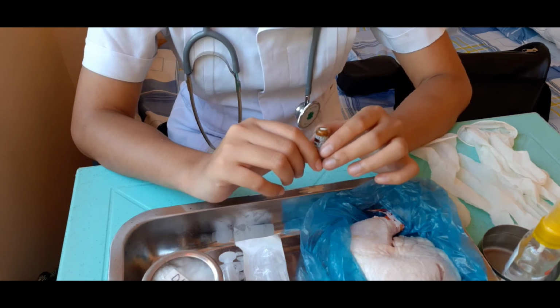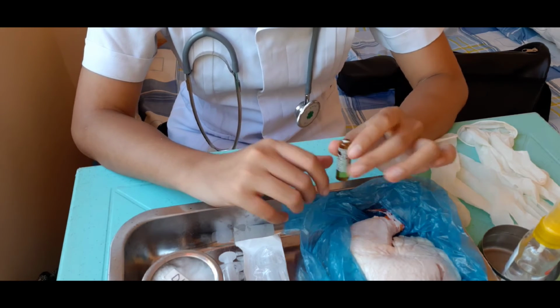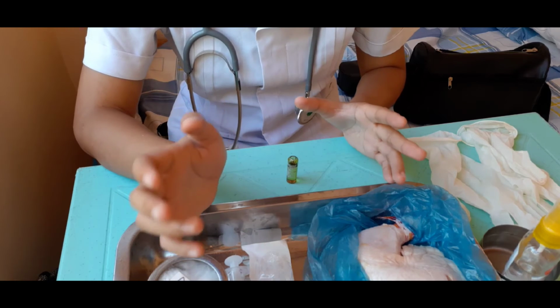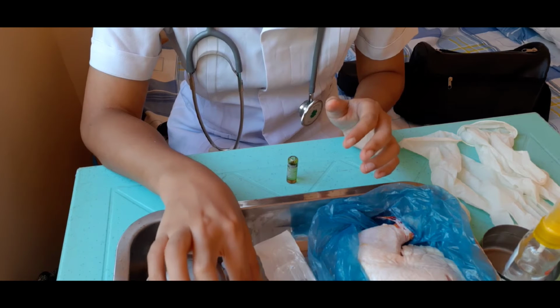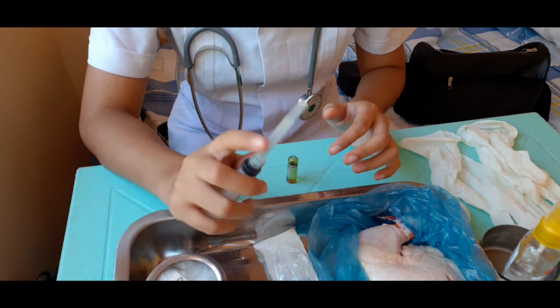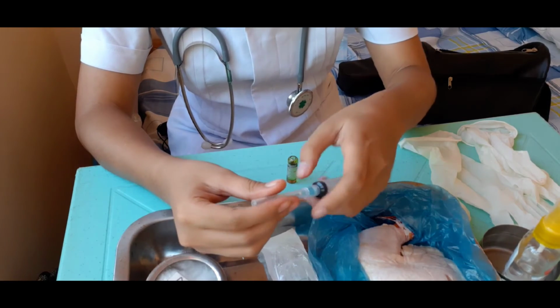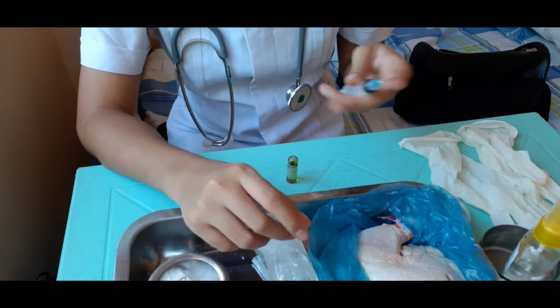So, now we are going to withdraw the medication of our patient. First, we need to place the ampule on a flat surface. And then, attach a filter needle straw. I have no filter needle, so I'm going to insert the needle at the center of the ampule and withdraw directly, since I don't have a filter needle, which is a very important piece of equipment. So, I'm going to open the needle now.